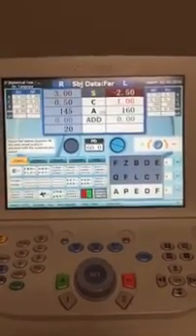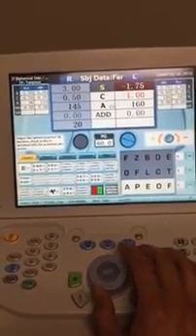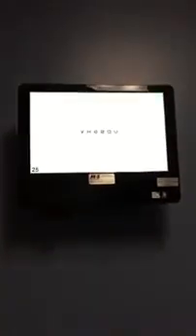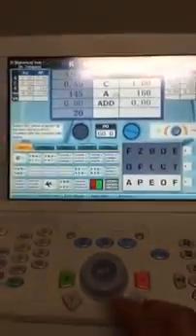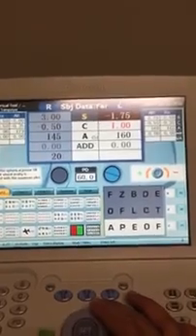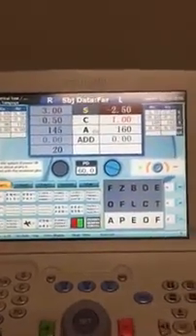We'll go up to the sphere. We're gonna go ahead and fog. And for me, you can keep it on the APEOF line. I like to change it, so I'll go to my remote here and I'll press 25 right here, and that'll change it to a different set of letters, as you can see. And then I will unfog until they can read the letters. So I'm gonna go here and turn it to the minus side until they can read, and say they can read right there.